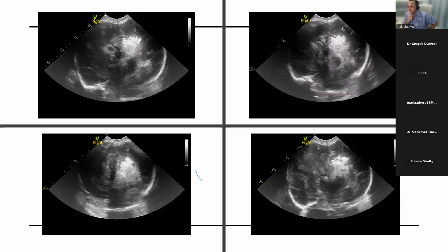So you're absolutely right. Basically, normal anatomy is completely effaced. Even in the midline views, I can barely see a Sylvian fissure. There's just very gross cerebral edema, no sulci, and this large echogenic lesion on the left side. Maybe with the eye of faith, I can see a lateral ventricle here and some of the midline on the right side, but on the left side, there's this large echogenic lesion. Now, it could be a parenchymal infarct, could be hemorrhagic, either of the two. We can't be sure. But what you can see is that it's less echoic here and very echoic here. So it could be a mix of both, maybe a parenchymal infarct where there has been hemorrhage.